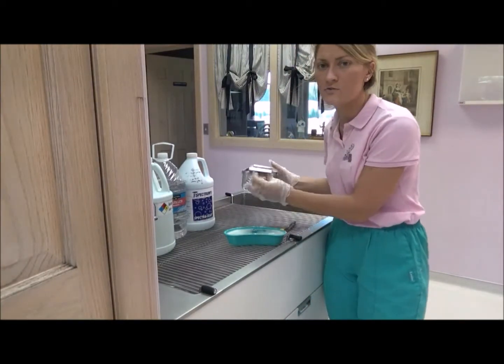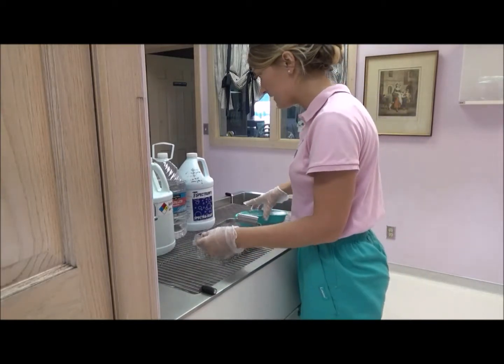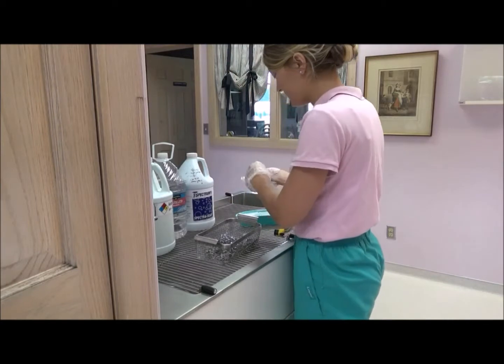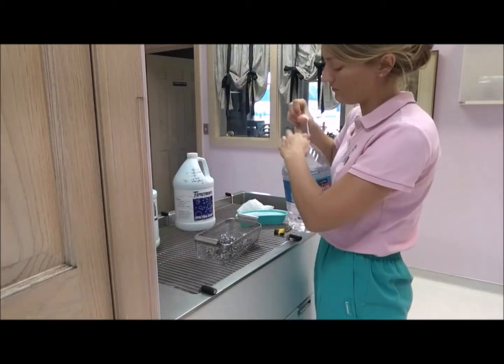So that was our last tool. Then what I do, I just rinse them off with some distilled water just before I put them in the ultrasonic.